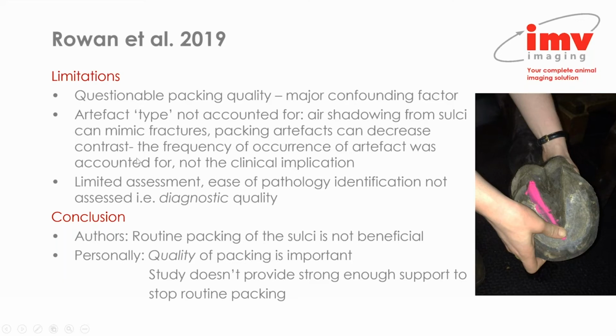Also, it is quite possible that the decreased contrast, if that was one of the major artifacts caused by packing, could have been contributed to by the fact that I think these feet were very heavily packed with Play-Doh.